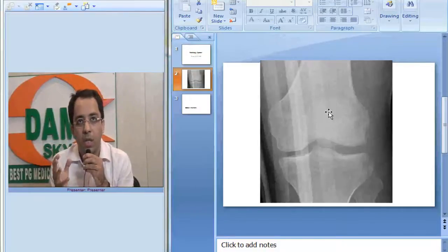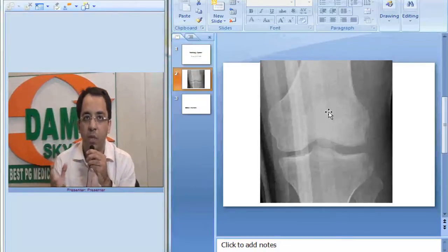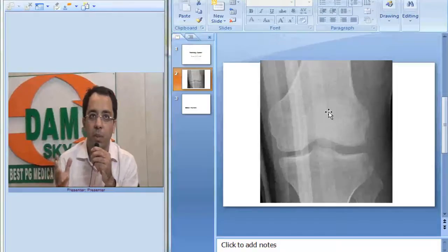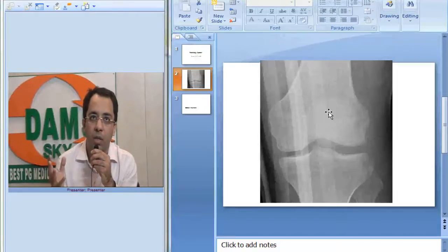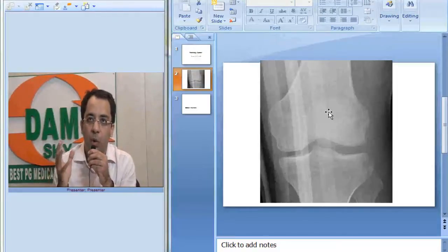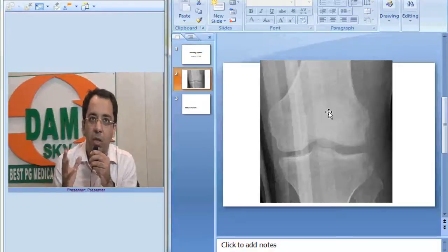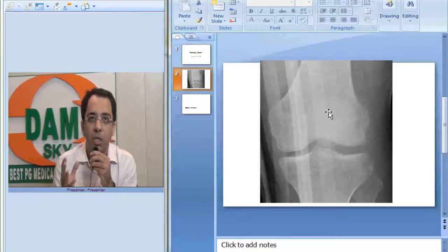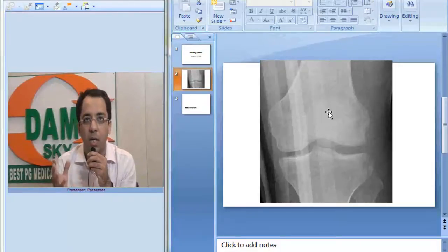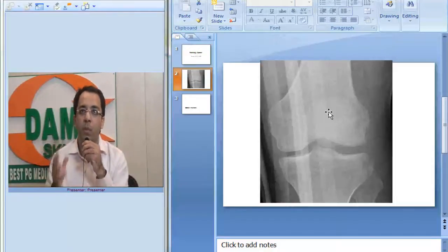These patients also in approximately 70% of cases would show a meniscal tear as well. So, the importance of a Segond fracture on a plain film reporting is the association with ACL tear and meniscal tears.